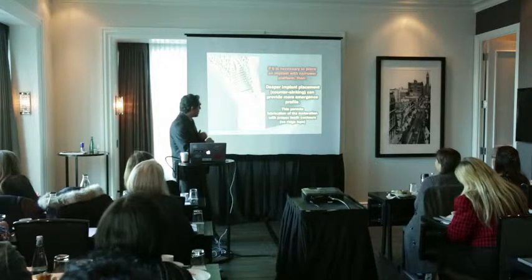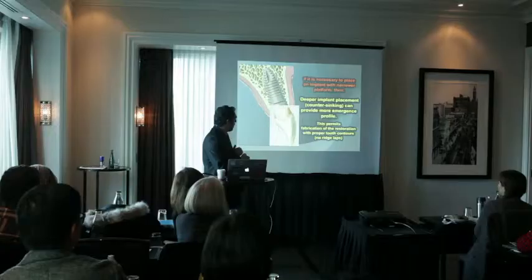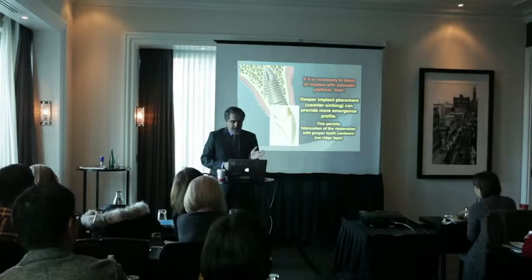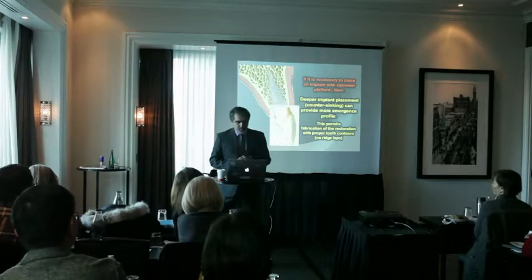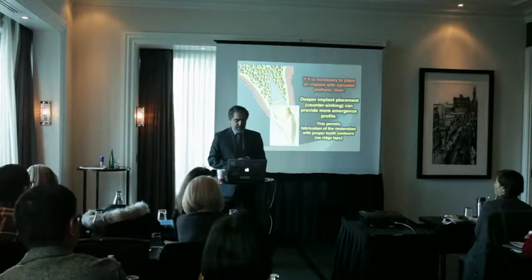And then the smaller size implant can be placed here. It's mostly because from this platform all the way to here, you have the opportunity to develop your emergence profile. Now with this background, here are the lines, as you can see.